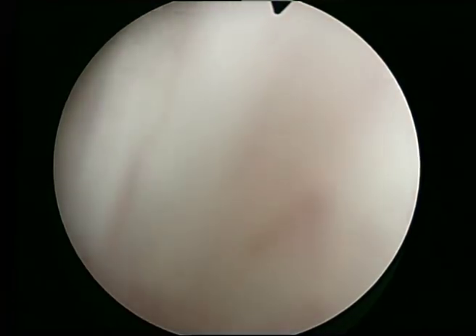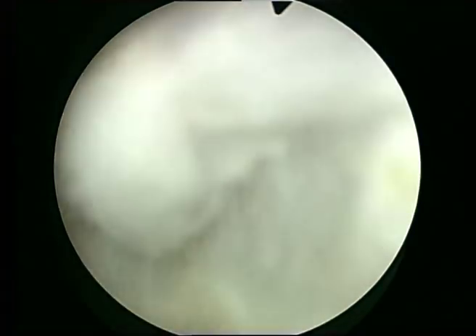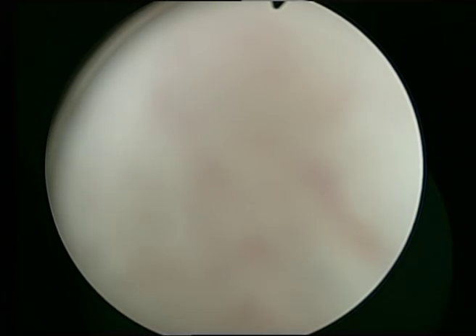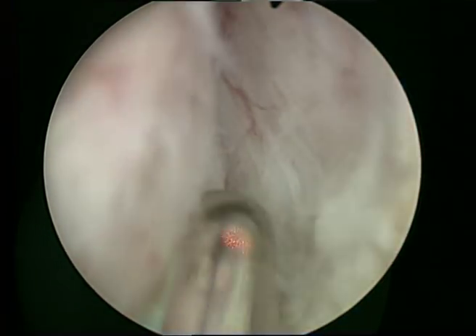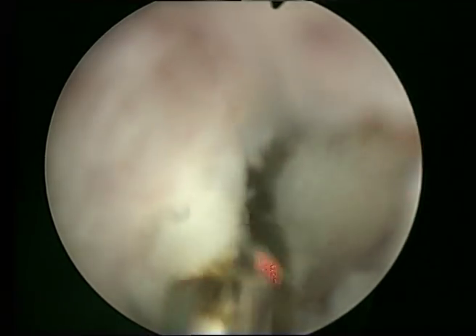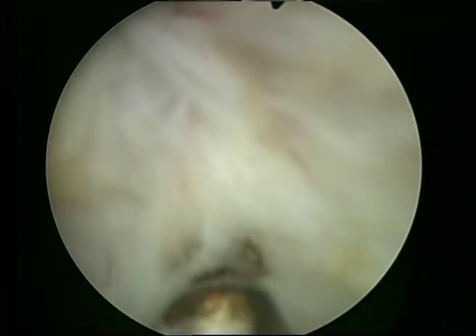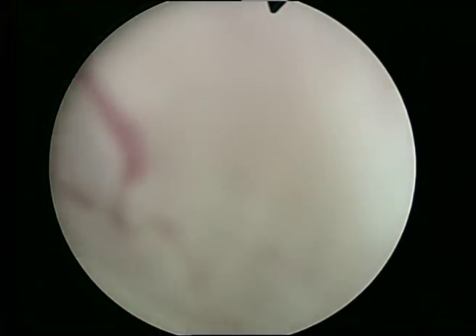Keeping in the plane and moving from side to side makes it very difficult to lose the proper dissection plane. We alternate mechanical pressure to separate the adenoma from the capsule with coagulation from the laser fiber. When we separate the adenoma from the capsule there is some bleeding, so progressively you have to control the bleeding to maintain good visibility and avoid significant blood loss. Usually there's not a big blood loss in this procedure, and as you will see, the visibility is amazingly good throughout the procedure if you are careful enough to do your hemostasis as you progress.